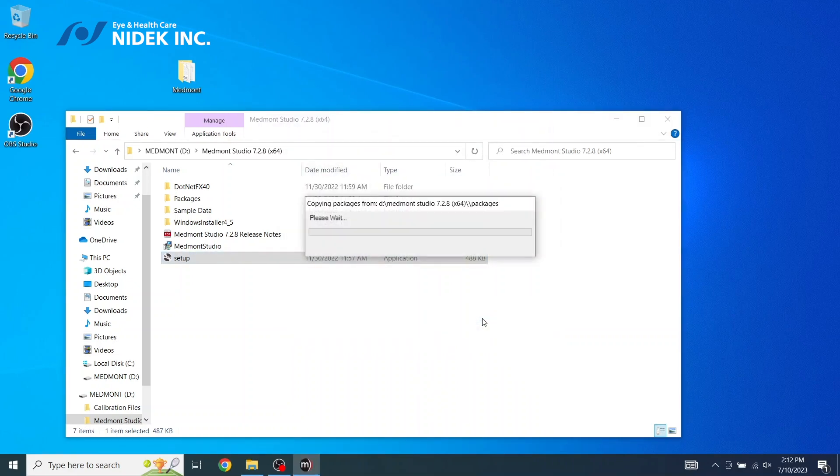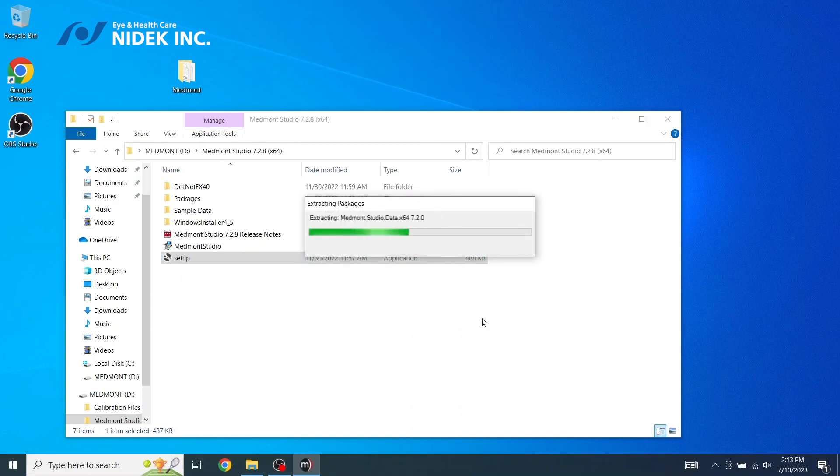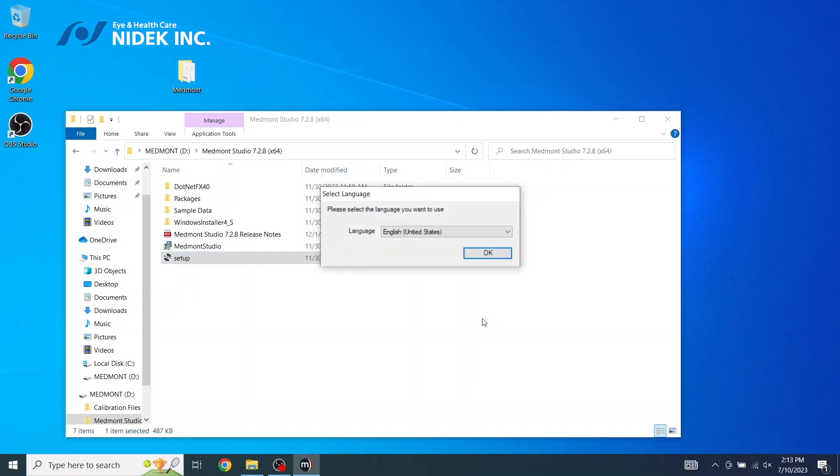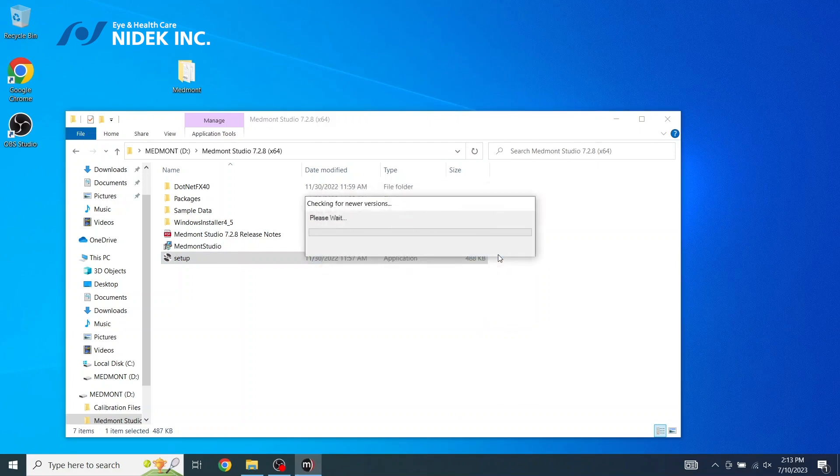At this point, the configuration will continue. Select your language, click OK.